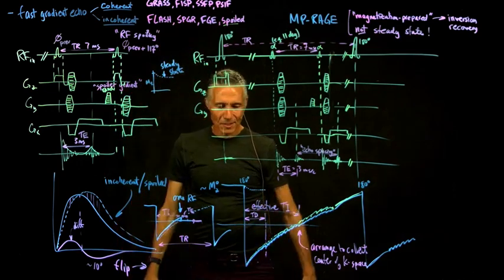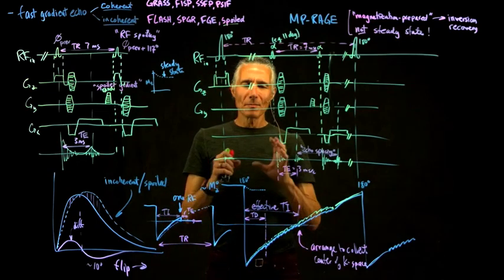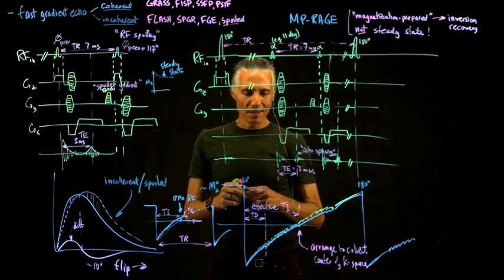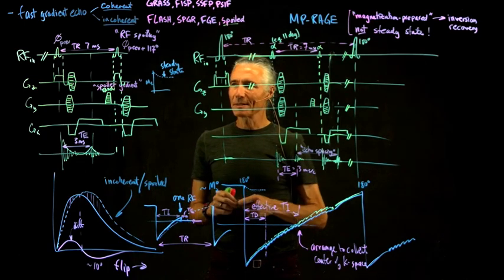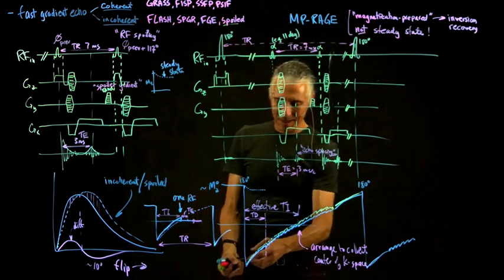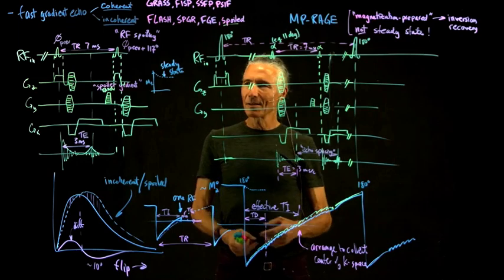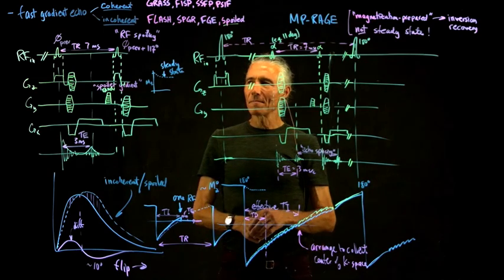Okay, so that's one of the most common T1 weighted scans that's used on a regular basis. So we finally got to, again, it's a slightly twisted thing, because you've got this non-steady state thing going on, but it has extremely good gray-white contrast, and so people routinely use it.